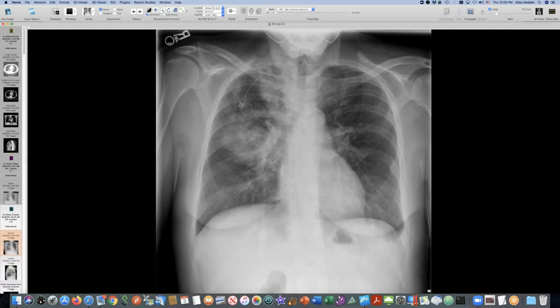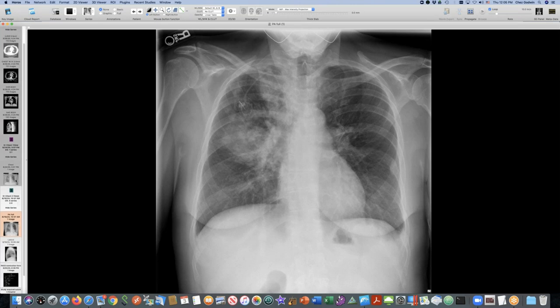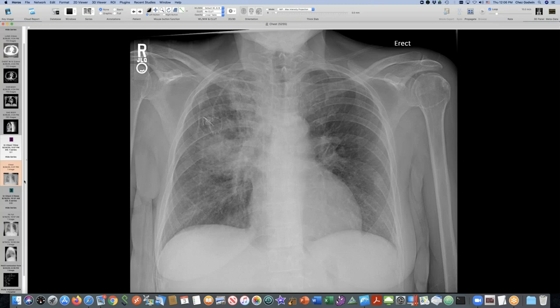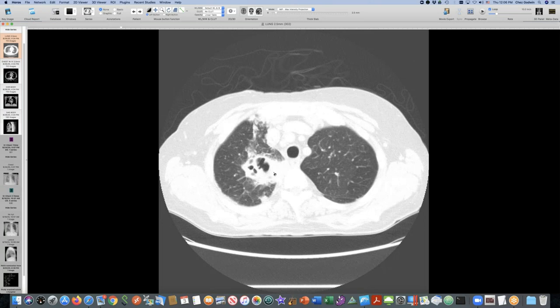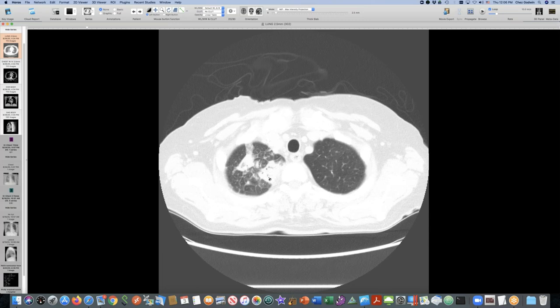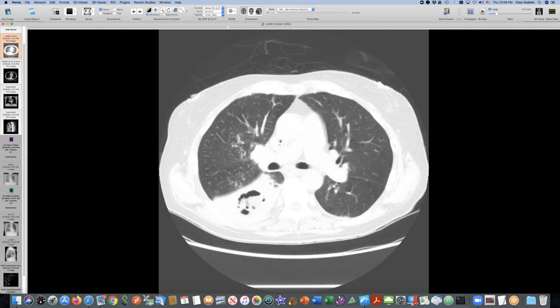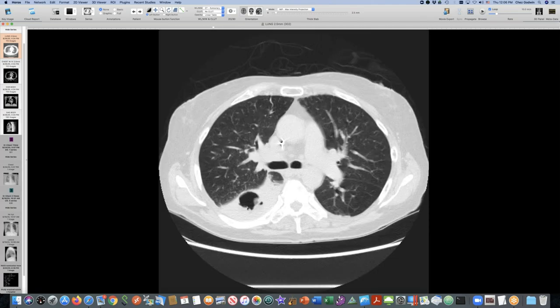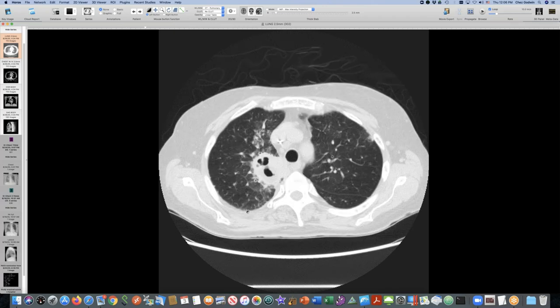Let me show you this second case. This is also a chemotherapy patient who developed this big lung consolidation in mid-August. Then we have a follow-up radiograph a few days later on the 24th. We still have this consolidation. There may be a lucency within it. There's another big patch of consolidation in the right apex. This neutropenic patient has a cavitary lung lesion in the apex. Consolidation with cavitation, this big lesion here, and then a big lower lobe lesion also with cavitation. Not much in the way of pleural effusion, but it looks like a pretty bad infection.